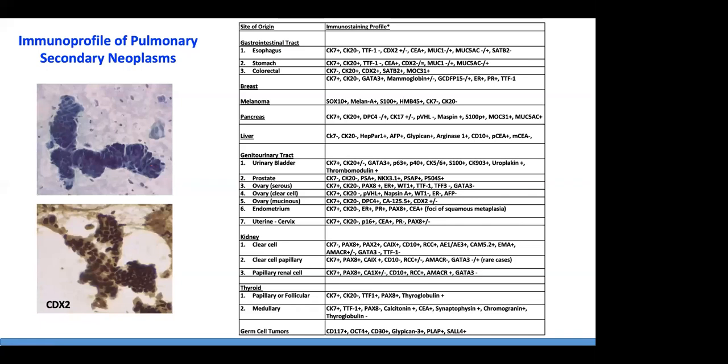If it is a secondary neoplasia, in general, we have a clinical history. So the patient has a previous cancer and now a pulmonary nodule, but sometimes not. So we can apply the classical panels that we have in this table, and this table will be in the book also with the different panels that we can apply.